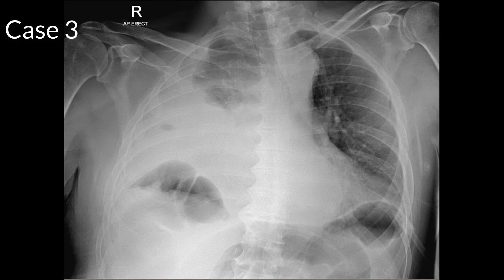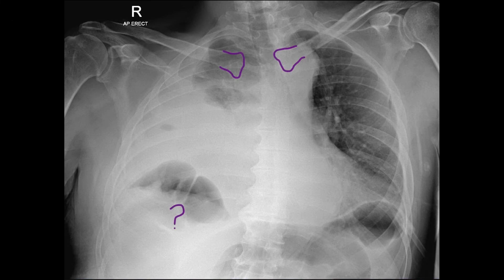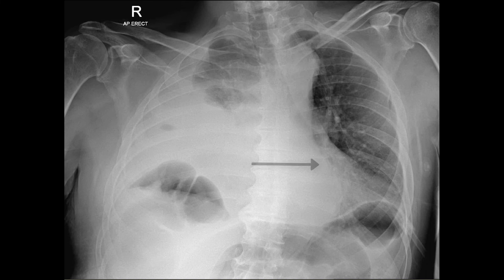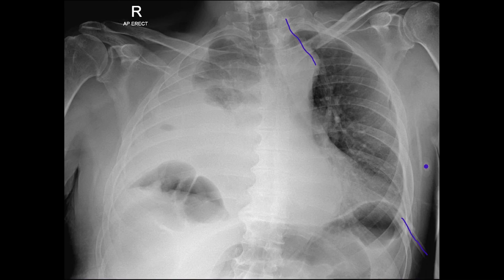The final case — there's a lot going on. A, adequacy and alignment: it's rotated, and I can't see the right hemidiaphragm — I wonder if it's ruptured. B, bones: I can't see any fractures, but there's a slight scoliosis to the left. L, lungs: there's a right hemothorax; the left hemithorax looks okay. S, soft tissue: the heart's pushed across, the mediastinum looks okay. I'm wondering about that bowel — whether it's actually in the right side of the chest. The subcutaneous soft tissues look okay. Software: there's an ECG lead and oxygen tubing. It helps to have a systematic approach — A, B, L, S.